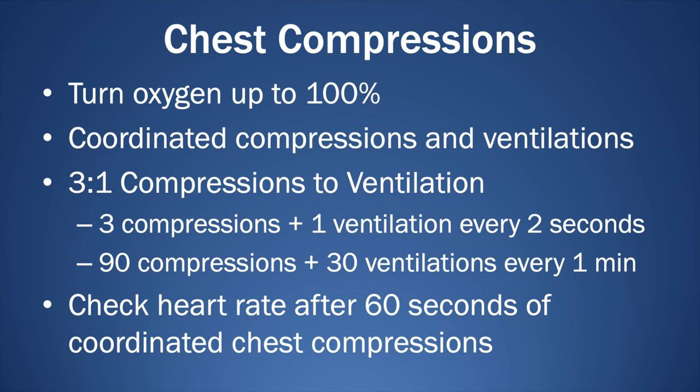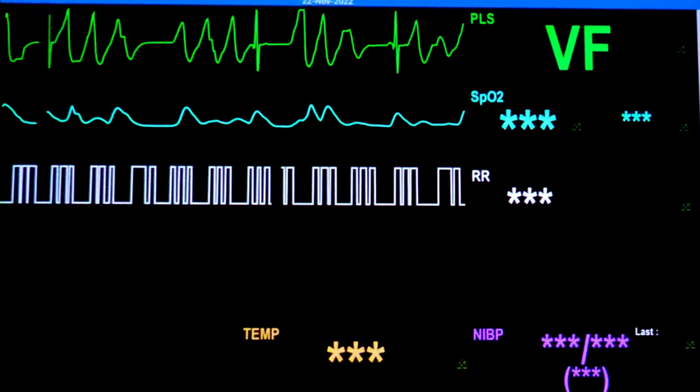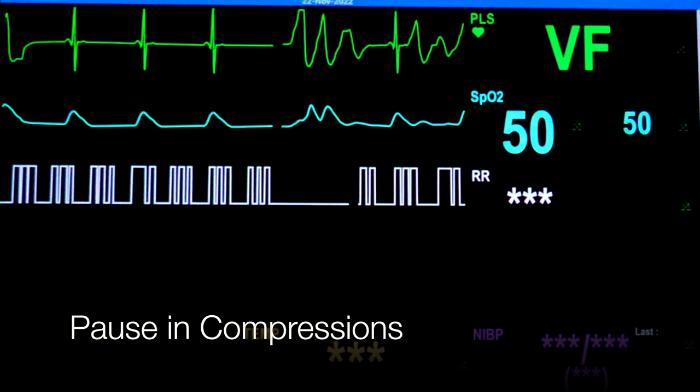Compressions in neonates are always coordinated with ventilation. Compressions and ventilations are done in a 3-to-1 ratio every 2 seconds. This will equal 90 compressions and 30 ventilations every minute. Continue coordinated chest compressions for at least 60 seconds before pausing compressions to check the heart rate. Remember that the heart rate on the monitor from ECG or pulse ox will not be accurate while giving compressions, and compressions must be paused briefly to assess actual heart rate.